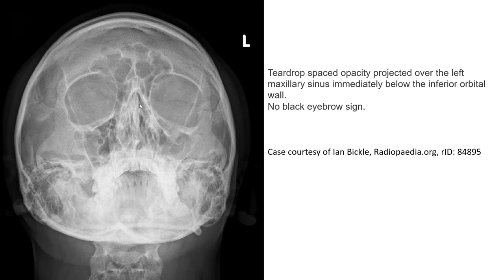Next case with a Water's sinus view, where we can see the signs of orbital fracture with a teardrop sign and opacification of the left maxillary sinus, but no black eyebrow sign.